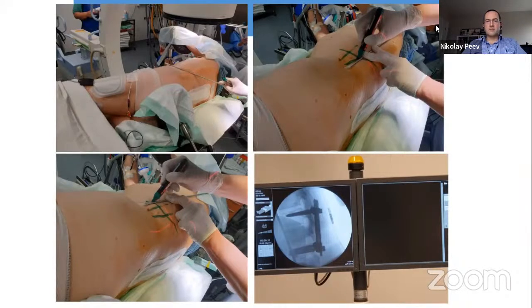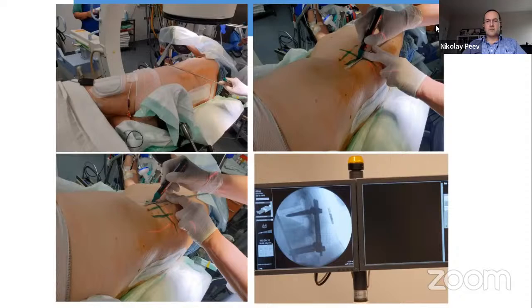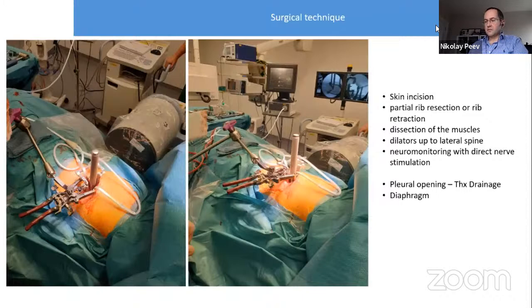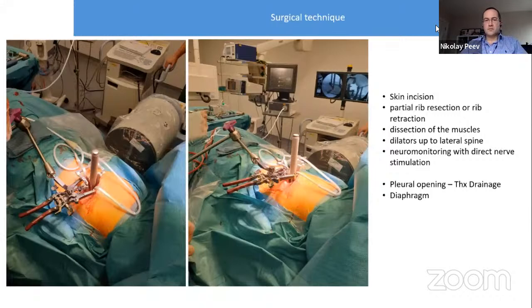The patient is secured with tape and placed in slight reverse Trendelenburg position. The head of the table is dropped and slight flexion is applied, allowing better access to the lumbar spine. For fluoroscopy control, first a true AP image should be obtained to ensure the patient is in a true lateral position with equidistant pedicles from the spinous process. A lateral X-ray is obtained, and it is critical that the C-arm remain at 0 and 90 degrees at all times to ensure a safe lateral working channel. After a single skin incision, the subcutaneous fat layers are dissected until the abdominal musculature.